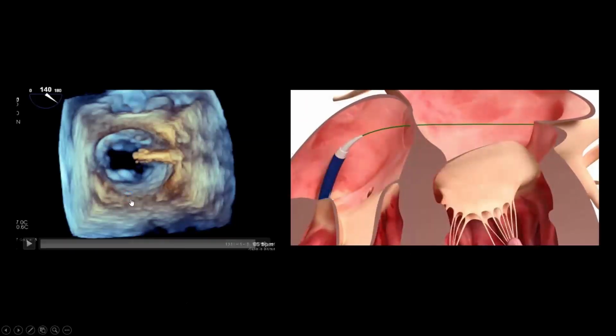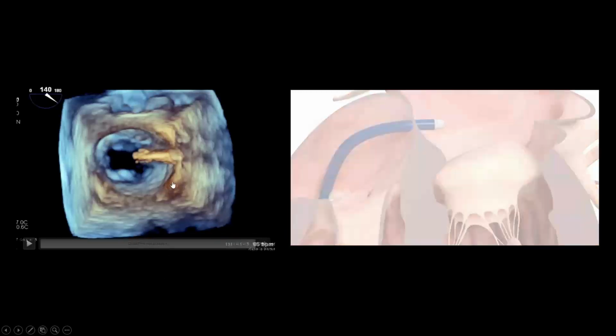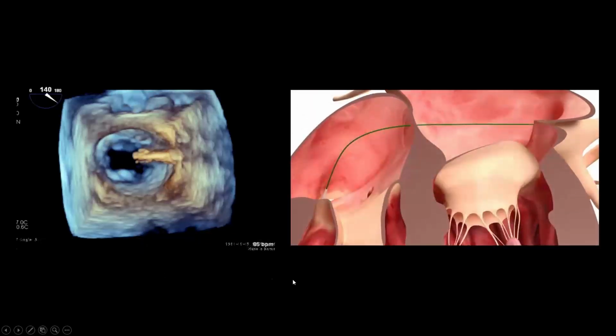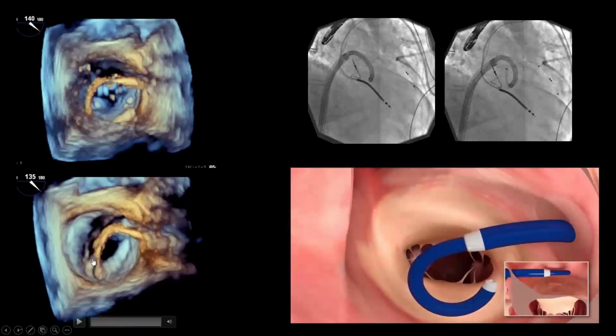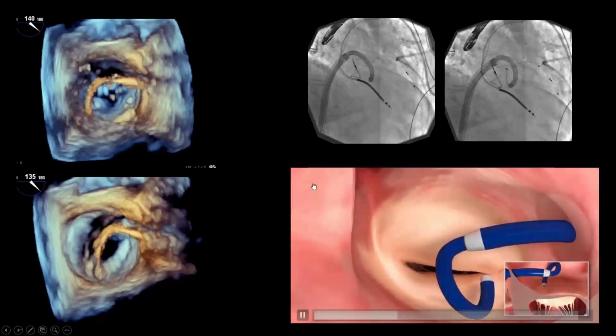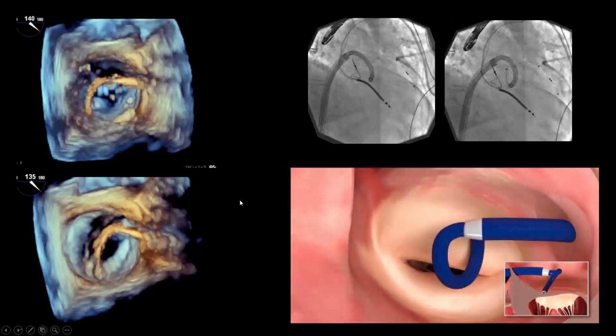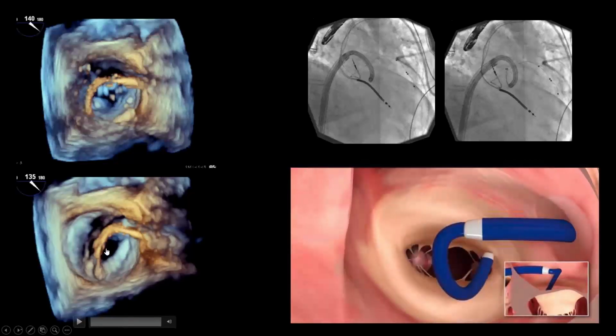So in our particular patient, we took her to the cath lab. The videos are working now because I switched to a Windows computer. Essentially, we crossed the interatrial septum with the delivery catheter. And then after that, we would advance the docking system, as you can see here, and then we would lower the docking system and advance it towards the medial commissure of the mitral valve. This is one of the things about this device: you need to have a healthy medial commissure. You can't really have a diseased medial commissure, as this is where the dock will be advanced into the left ventricle.